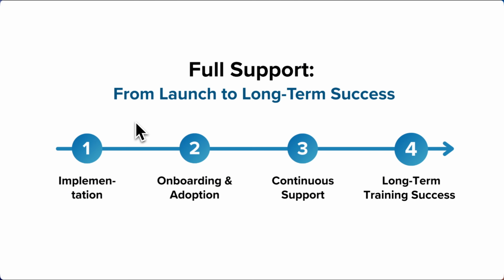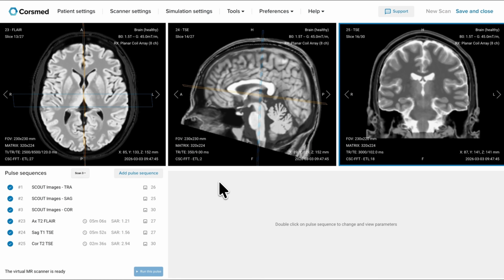With Corsmed, you get full support throughout your entire journey with us, from implementation, onboarding, to continuous support and long-term success for your MRI training program. We will be there at every step and help you create the best learning experience for your organization.